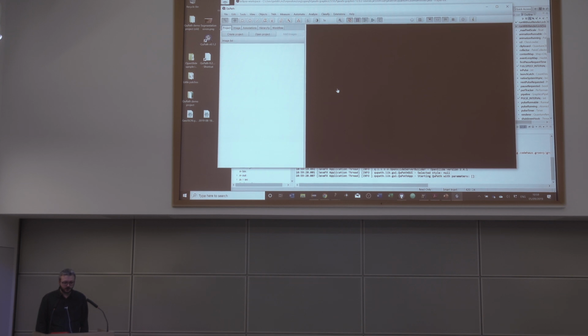One of the other things that I've been doing recently is making it possible for QuPath to transform an image as it's being displayed. So it could apply a color normalization, something like that, all calculated dynamically as you view the image. So it could be the case that you try and normalize the image to deal with the problem that way. Or it could be the case that you train up a model which is hopefully robust to those variations and then apply that. None of that is currently within QuPath, but it should support either solution whenever somebody develops one.